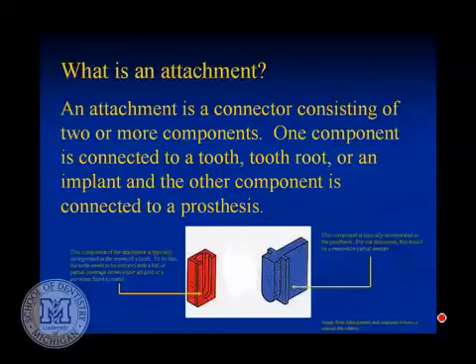If you look through these attachment catalogs or go through this website, there are many extremely seductive looking attachments because they look sort of like a Rolex watch. You're going, ooh, that'll be so cool, click, springs and pops. Well, part of the thing is, now think about maintaining them.